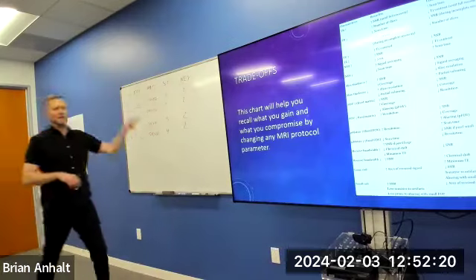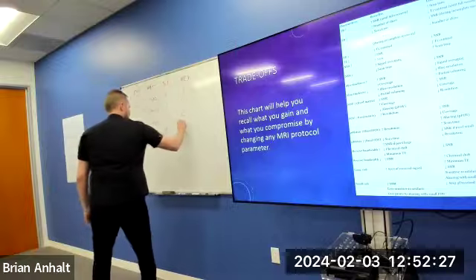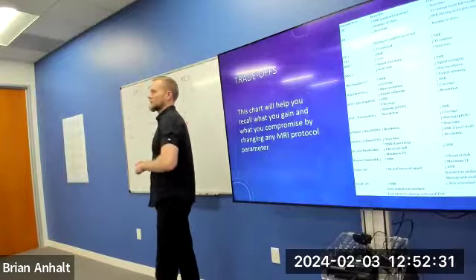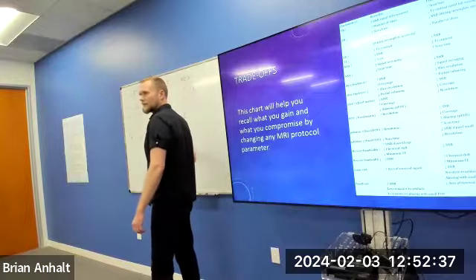Does NEX have anything to do with resolution? Did I just give this better resolution by doing that? Hell no. Resolution is affected by voxel size. Does that change my voxel size? Not at all, right?